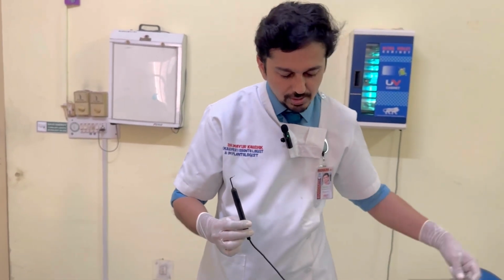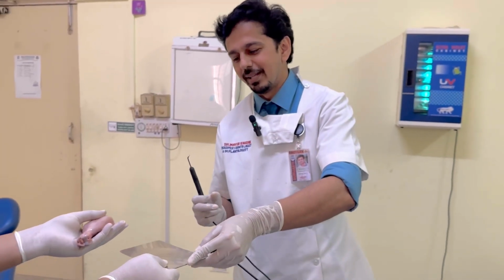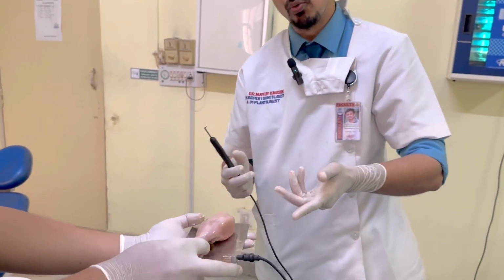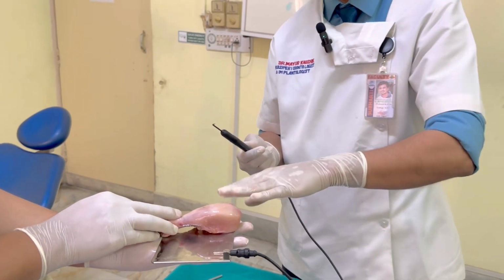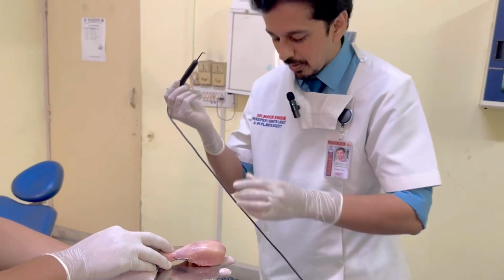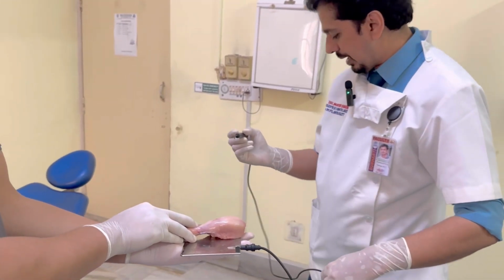So for incision, first and foremost, a conduction plate is required, and that conduction plate is put on the tissue or the patient's back wherever we are planning to do the surgery, meaning the patient becomes a part of the circuit once we are using a conduction plate. So now I am ready to do my incision with electrosurgery.